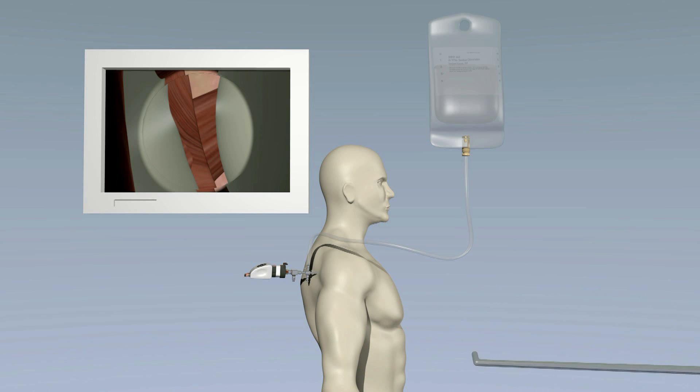A small metal probe is often used to examine different structures in the shoulder.